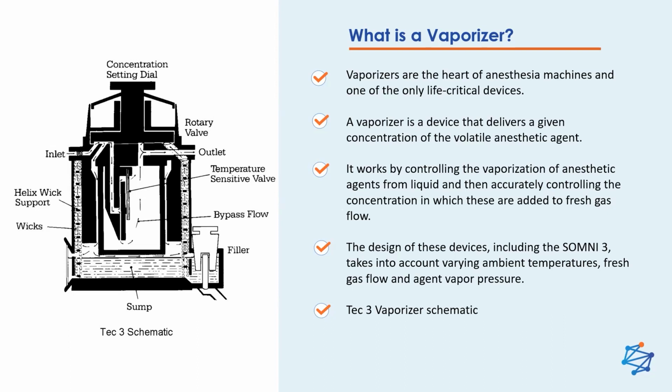The thermostat is crucial for regulating temperature and pressure compensation, and the thermostat works in conjunction with the rotary valve to provide an accurate vapor delivery percentage at each dial setting. The dial is used as a visual indicator of the percentage of vapor delivered to the patient, and the dial markings are established during the calibration of the vaporizer. So each vaporizer has a unique calibration setting, which the dial should reflect accordingly. Your ISO dials range from 0 to 5%, and the SEVO dial will range 0 to 8%.